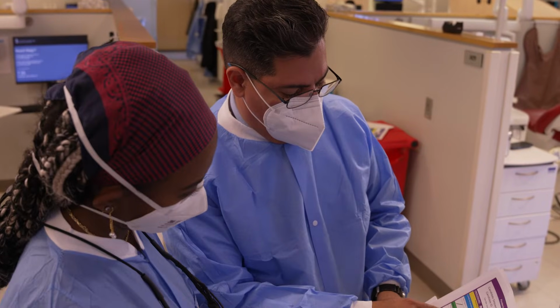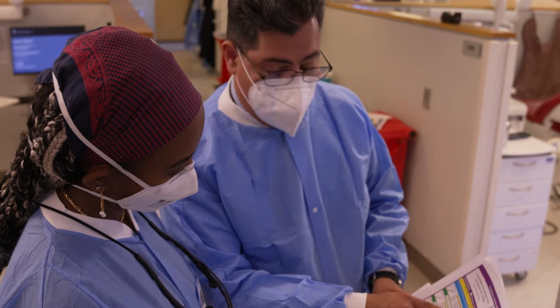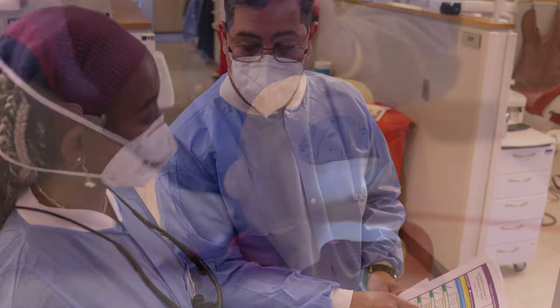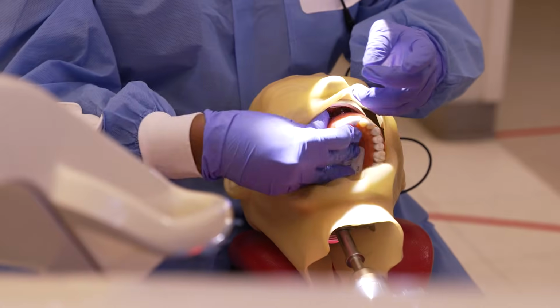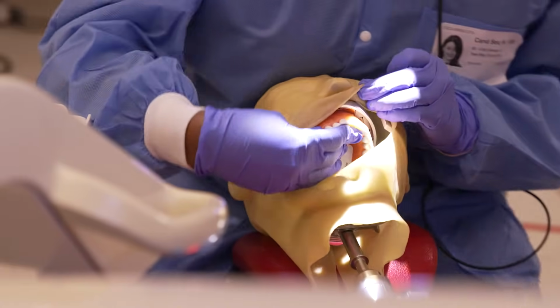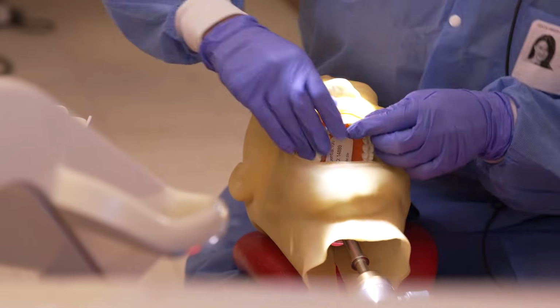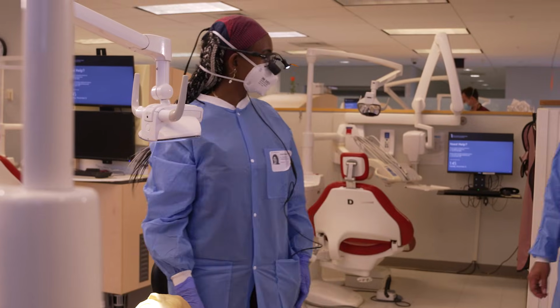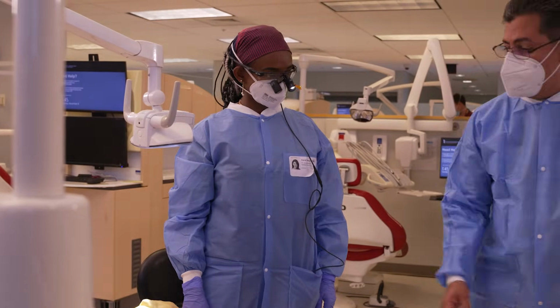One modification, the first one, was granted, so that means that you will be able to do it. Okay. Second modification is not granted. Make the modifications as approved. If you determine the preparation needs a further modification, you may submit additional requests. Call a CFE when you're ready to submit your preparation for evaluation.